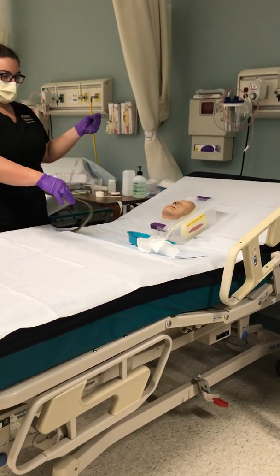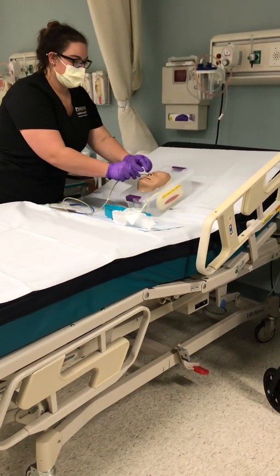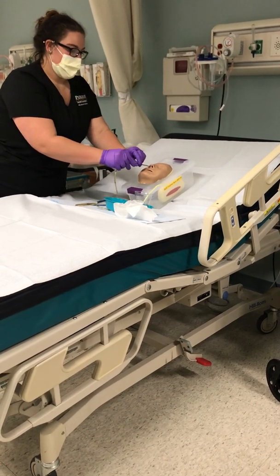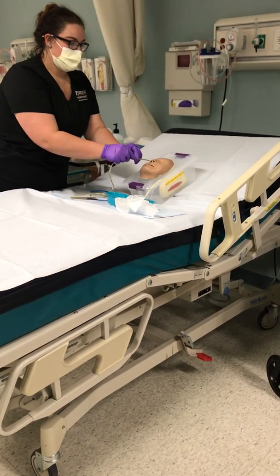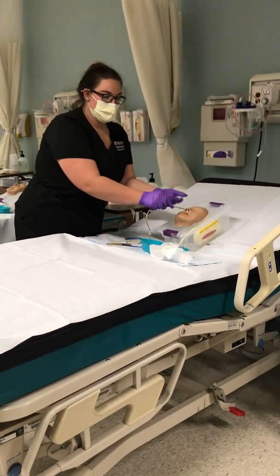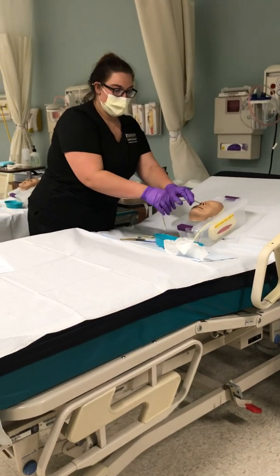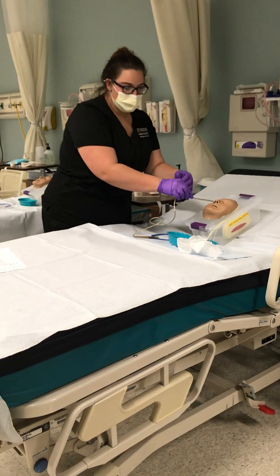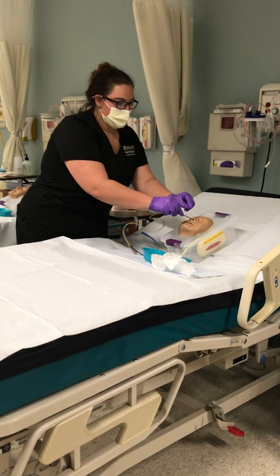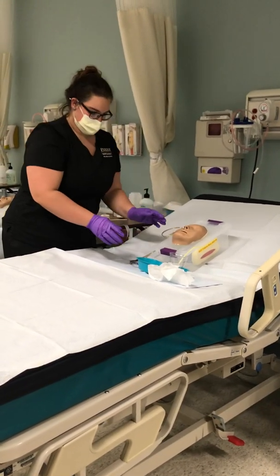I would explain to the patient that if there's some gagging or anything, we have water here for them, and so I'll begin by inserting the tube slowly, and if they begin to gag, I'll encourage them to sip some water. If they were to continue to gag, I will stop the insertion, and then have them continuously sip water until it gets the bearing, so that every time they swallow, I'm continuing to push the tube down. So once you have it in the appropriate spot, all the way to your measurement, you'll stop.